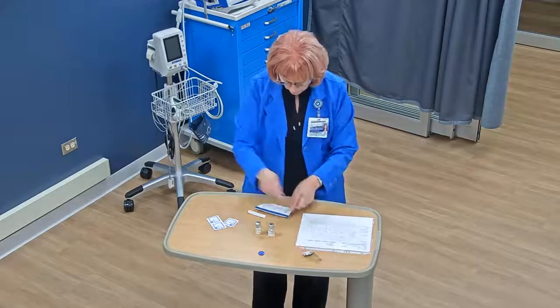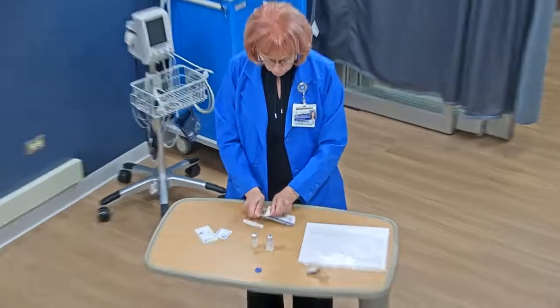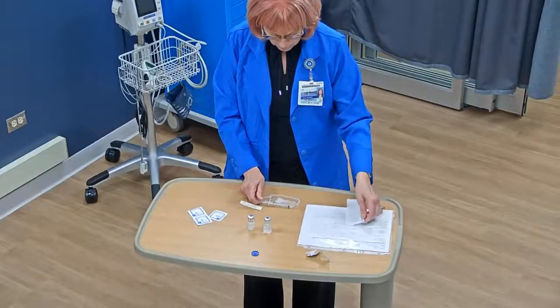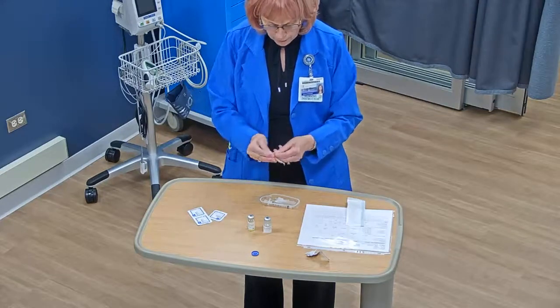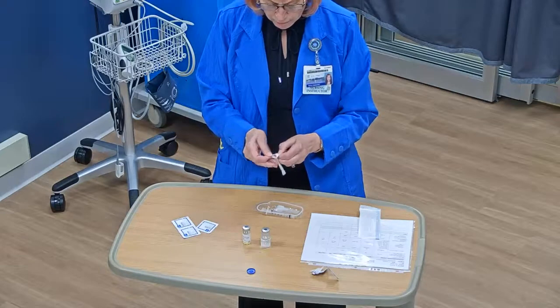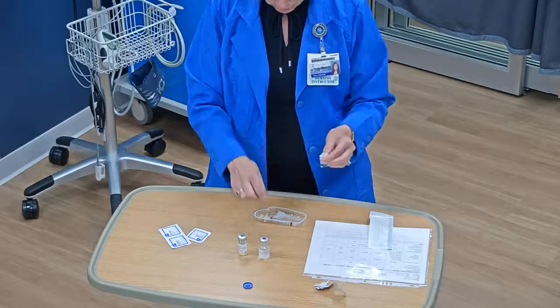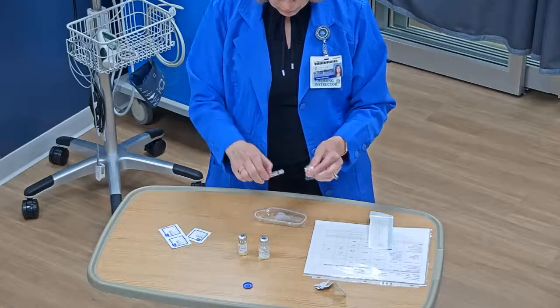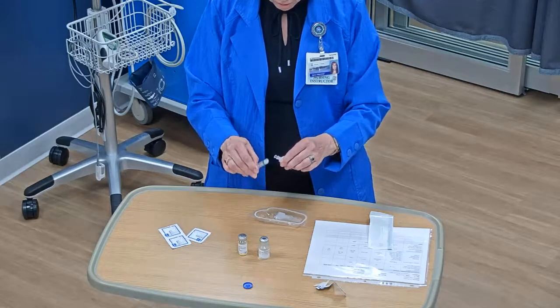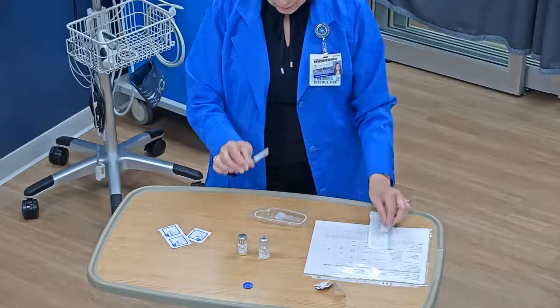Those are clean; I let them dry. In the meantime, I open up my syringe and needle package, with it resting right here on the table. Then I also open up my blunt cannula or vial access device. As I open this, I'm very careful not to touch the hub because the hub needs to stay sterile. I take out my syringe — the hub of this also has to stay sterile — and I connect the two using a twist.